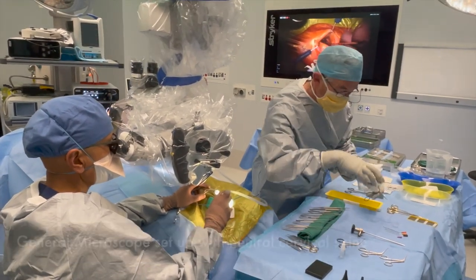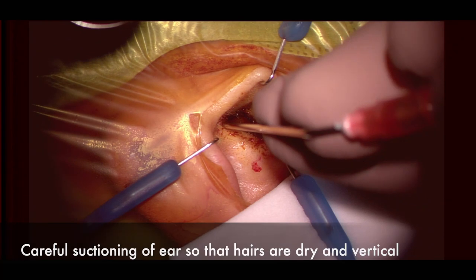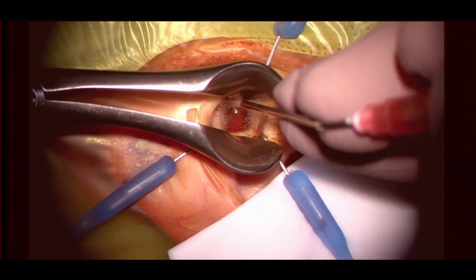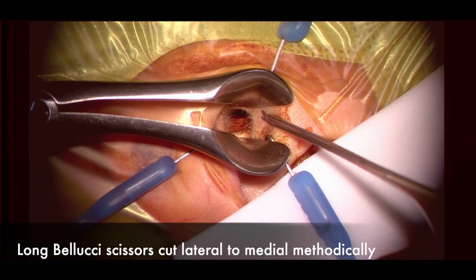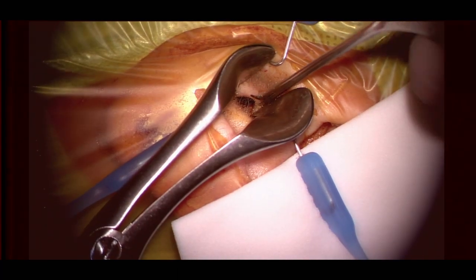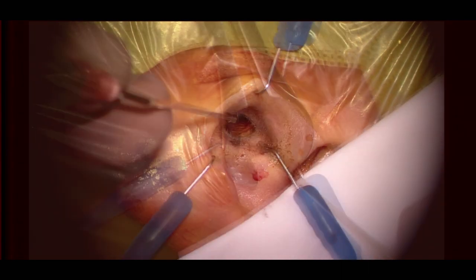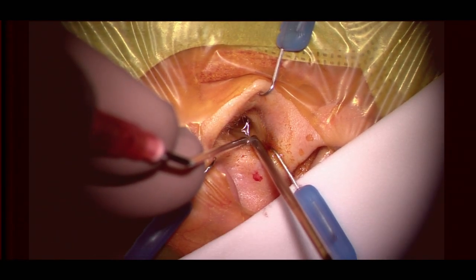Here's the general microscopic setup with a neutral cervical spine. I prepare the ear canal by suctioning very carefully around the hairs so they stand on end, allowing them to be cut at their bases with a Lempert aural speculum. The speculum stretches the ear canal in four quadrants, and we use Bellucci scissors from lateral to medial in four quadrants — superiorly, anteriorly, posteriorly, and inferiorly. The anterosuperior aspect where hairs are located is important; a stray hair will scrape your camera during the endoscopic case. Spend time cleaning the ear with irrigation.